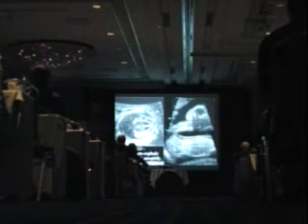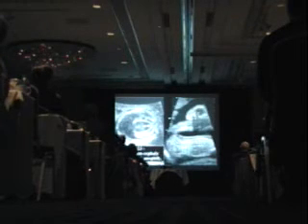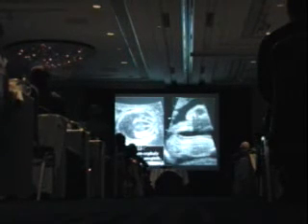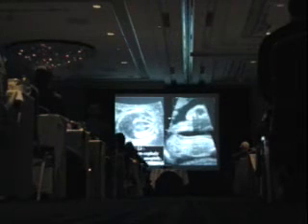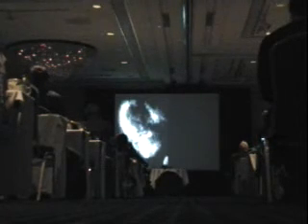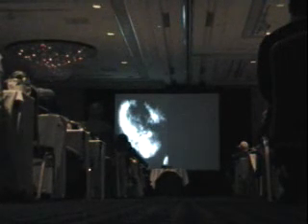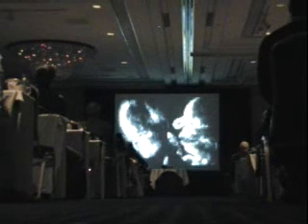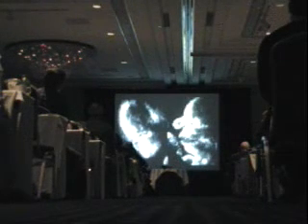This is actually a case that had not only holoprosencephaly here with fused thalami and a central orbit, this is cyclopia here, but also a banana sign. So now we've got two things. We've got a banana sign, so we've got a neural tube defect, which ended up being here. We have to look for it. But we also have holoprosencephaly. This fetus had trisomy 13. And the type of facial abnormality it had was that central orbit cyclopia, which if you turn the fetus to its side, you can see the proboscis that comes out in front here.